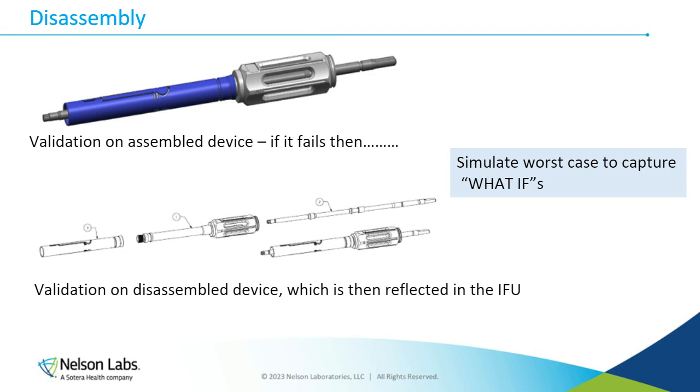One thing that regulatory talks about a lot is disassembly, right? If you have these features that are worst case to clean and are very difficult, can they be disassembled? And if they can, how are you disassembling them? And is it simple enough for the users to understand how to disassemble? You know how to disassemble them, or engineers know how to disassemble because they designed it. You give them to me, I may be able to figure it out, but you're giving it to the healthcare users that don't have the education level that either the lab, or the manufacturer, the engineers that are working on them have. So you have to break them apart like the way this has been broken apart.